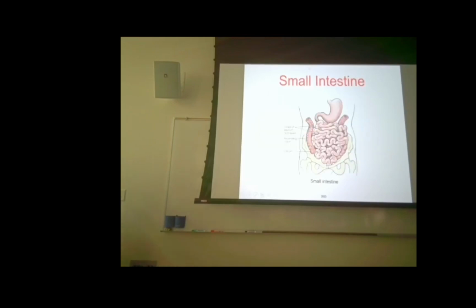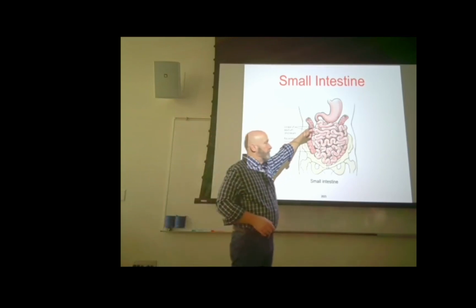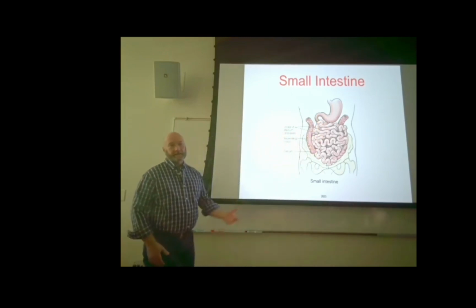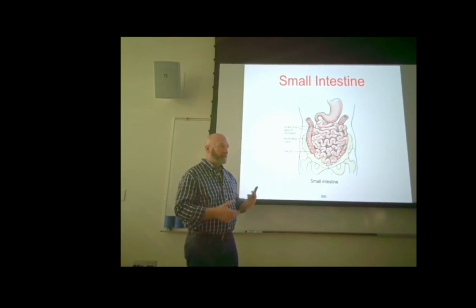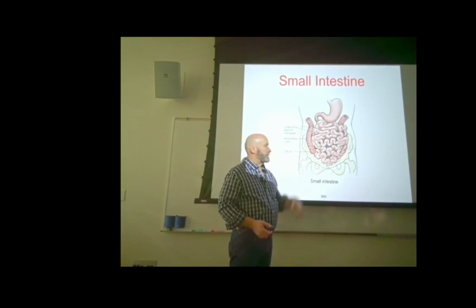So the small intestine just looks like a big wad of goo, right? When we do exams of the small intestine, it's kind of difficult to determine which portion we're looking at. Right after we have the patient drink, you'll probably see the duodenum is very high, way up here. There's your duodenum, and then it gets into the rest of it, and it's like, I have no idea what I'm looking at. But what we're looking for on that small intestine exam, and we'll talk about this in a bit, is where the small intestine and the large intestine meet.